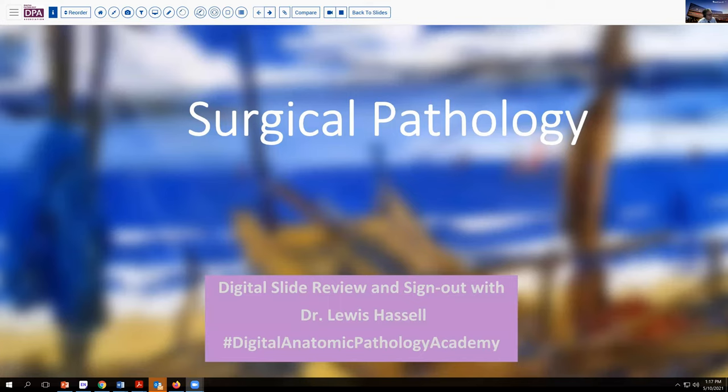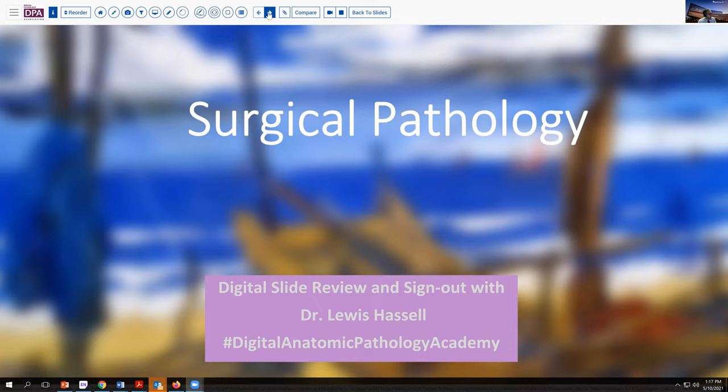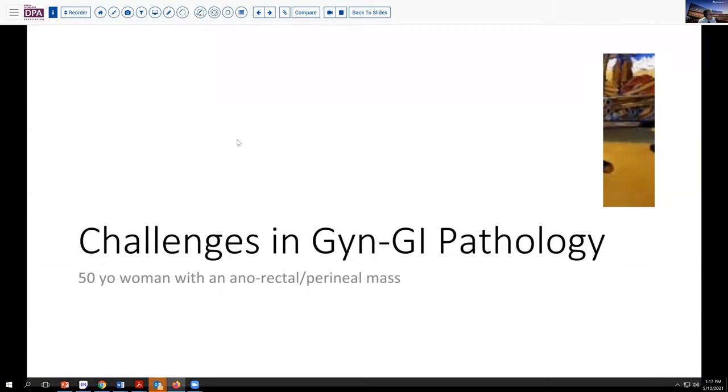Hello. Welcome again to a session of digital slide review and sign out on topics in surgical pathology. I'm Dr. Lewis Hassell, coming to you from the University of Oklahoma Health Sciences Center. Our program today is part of the Digital Anatomic Pathology Academy, courtesy of the Digital Pathology Association and PATH Presenter. We're talking today about a somewhat unique case, a challenge in GYN and GI pathology, with some interspersed aspects of breast and cutaneous pathology mixed in.